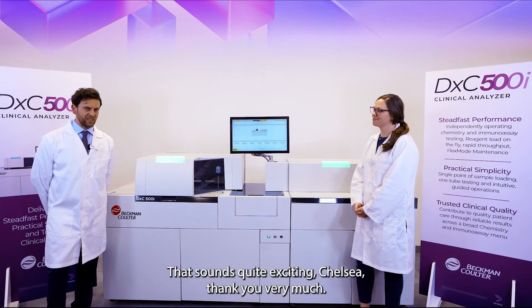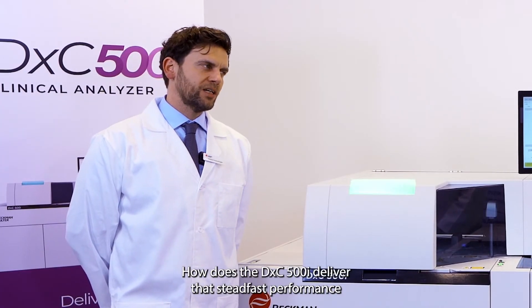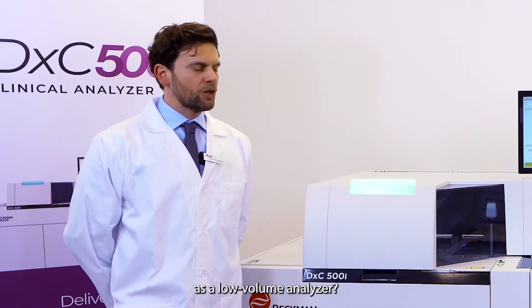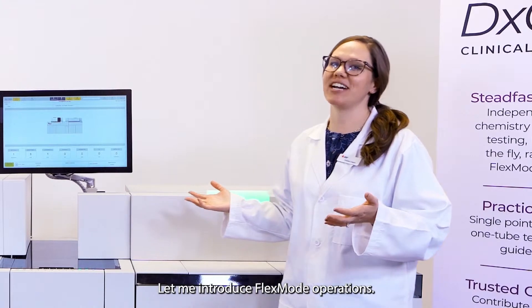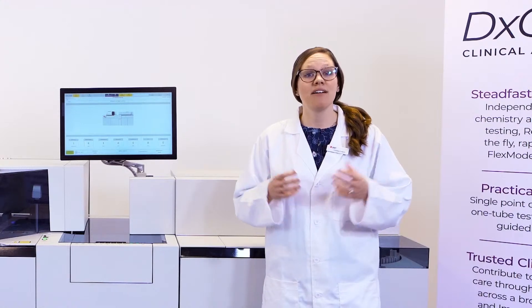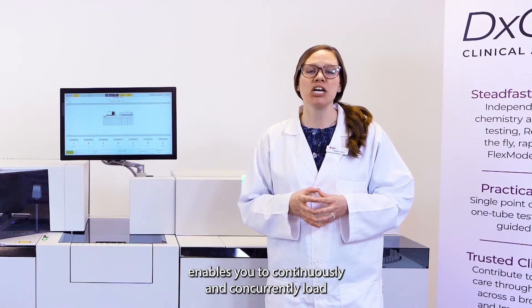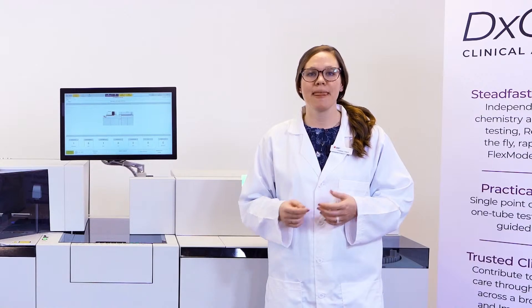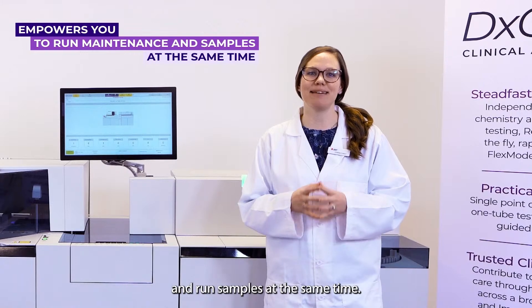That sounds quite exciting, Chelsea. Thank you very much. You mentioned steadfast performance — how does the DxC 500i deliver that as a low-volume analyzer? This is a great question. Let me introduce FlexMode Operation. FlexMode Operations enables you to continuously and concurrently load chemistry and immunoassay shared and stacked samples, and empowers you to run maintenance and run samples at the same time.